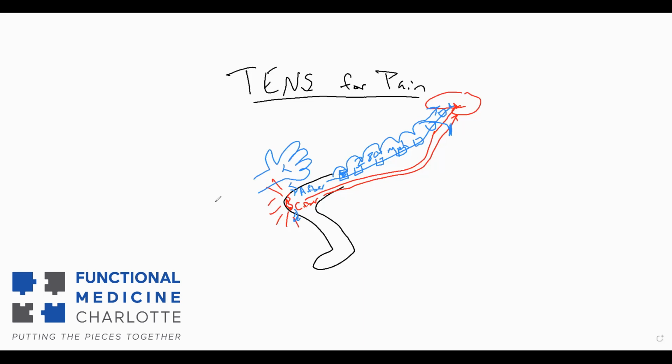Okay. And it comes with 2 sticky pads. Mhm. I'm assuming one goes where the pain is, but where does the other one go? This varies depending on what you're trying to treat, but if it's the knee, say, then you might want to put one sticky pad on the quad above the knee, and you could put the other one where it hurts, or you could put it below the knee, on the muscle below the knee, in the shin somewhere.